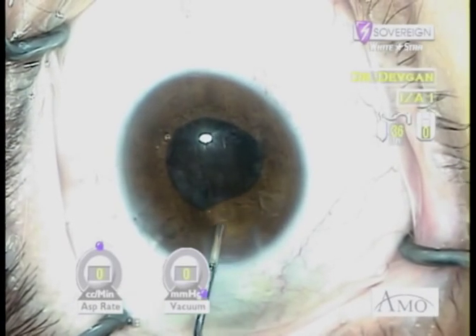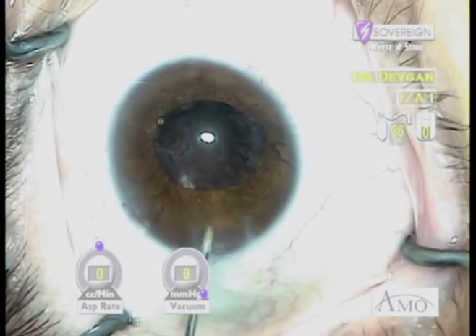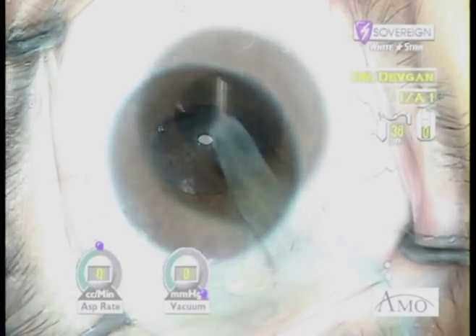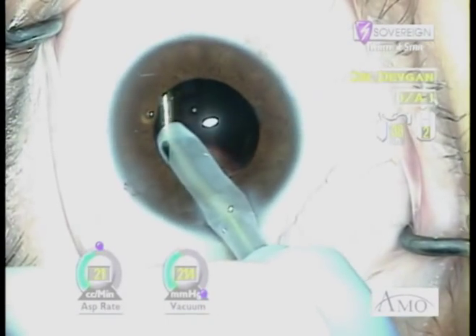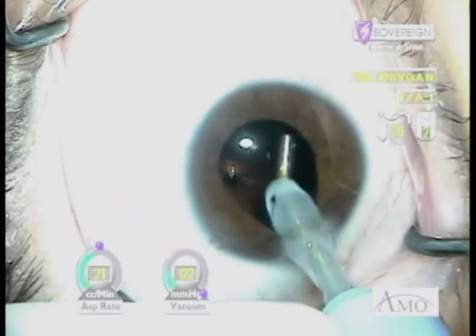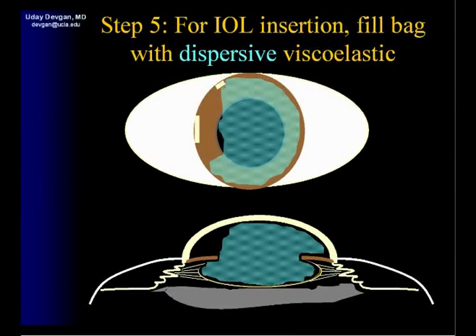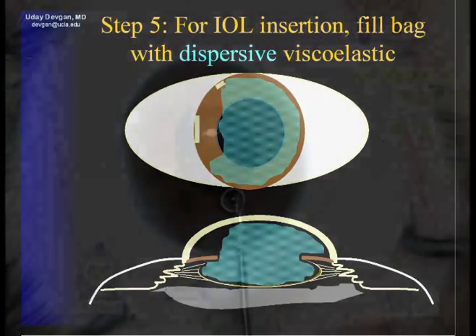By injecting this plug of Helon 5 at the sub-incisional iris we prevent iris prolapse. We'll go ahead and insert the IA probe and we can complete our cortex clean up in an easy fashion.